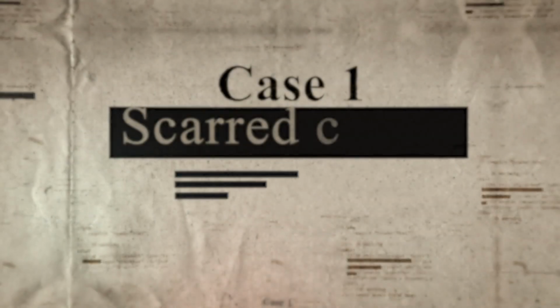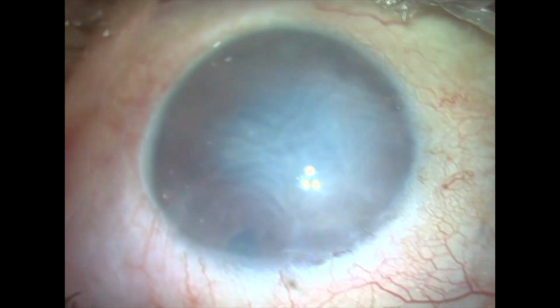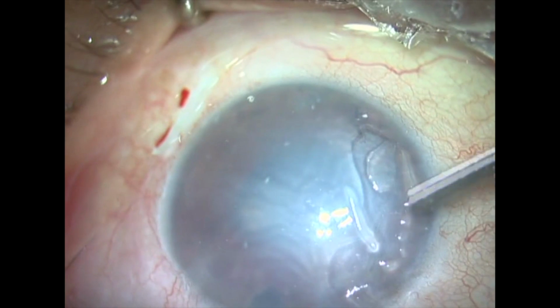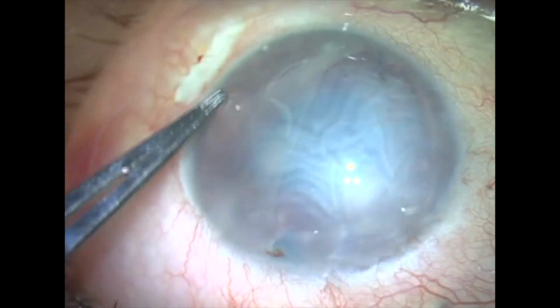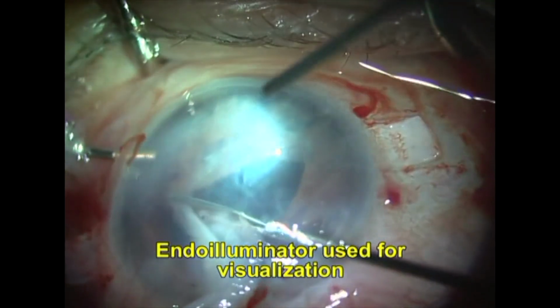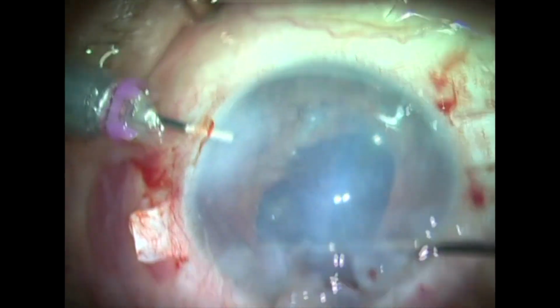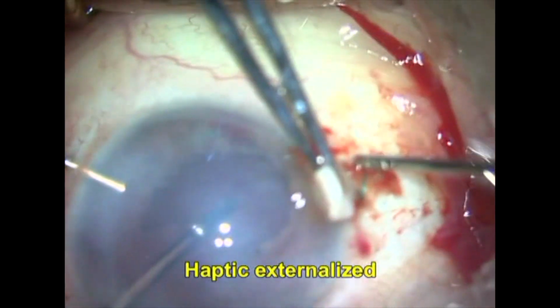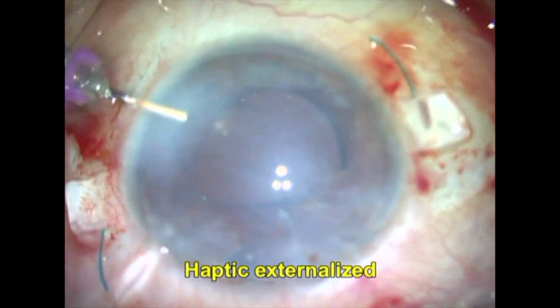The first case is of scarred cornea, in which visualization of the anterior chamber and beyond was arduous. Even after debriding the epithelium, coaxial light of the microscope doesn't help much in visualization. This is where the ENDOILLUMINATOR comes to the rescue. It helps to visualize and implant a glued IOL.